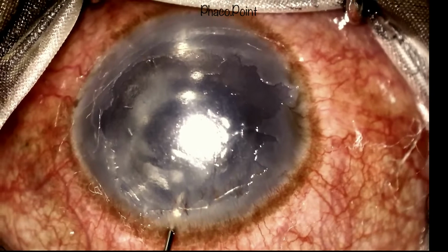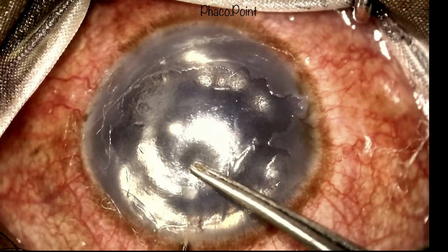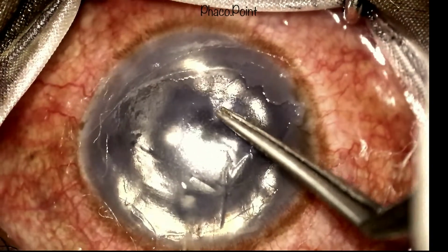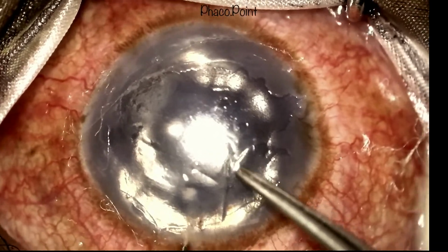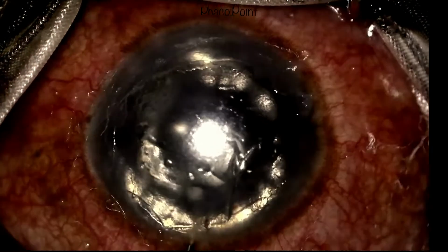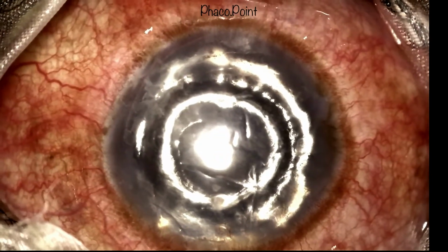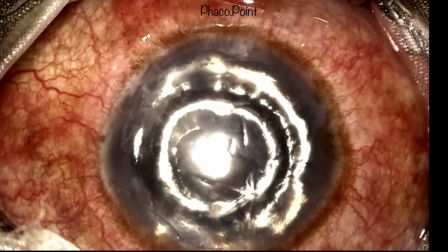At the end of the surgery, this is the end result that we achieved. As a last step, we just confirmed that there is no fluid coming out of the venting incisions. This now brings us to the end of the case. On table, what appears to be a completely reattached Descemet's membrane. Let's just compare now what it looked like before and after.